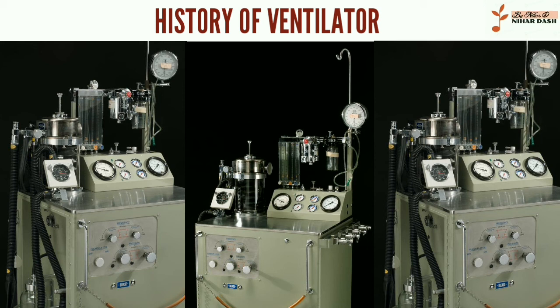It was an elegant design and became a great favorite with European anesthetists for 4 decades prior to the introduction of models controlled by electronics. It was independent of electrical power and caused no explosion hazard. The original Mark I unit was developed to become the Manley Mark II in collaboration with the Blease Company, which manufactured many thousands of these units.